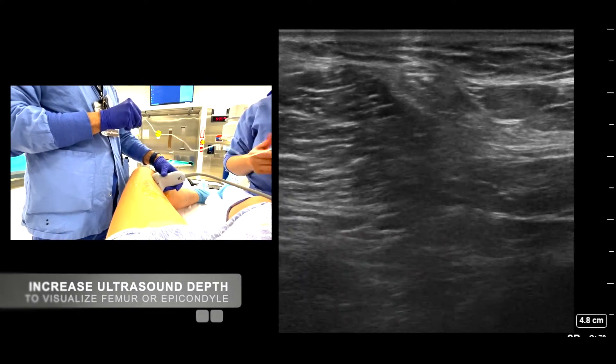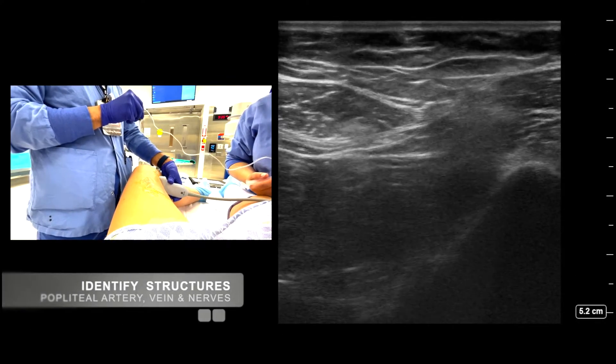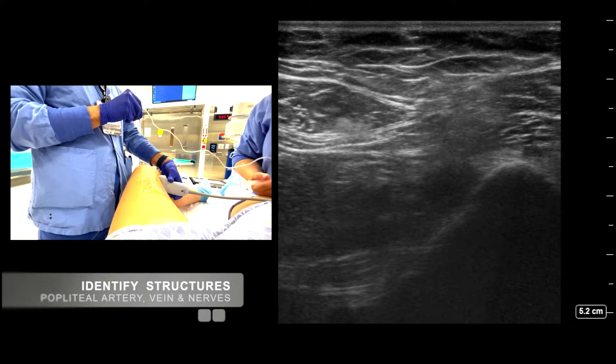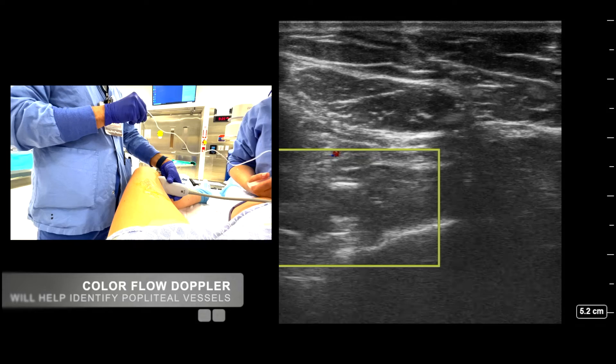Increase your ultrasound depth to visualize the femur or epicondyle. Identify the popliteal artery, vein, and nerves. Use Color Flow Doppler to help identify the popliteal vessels.